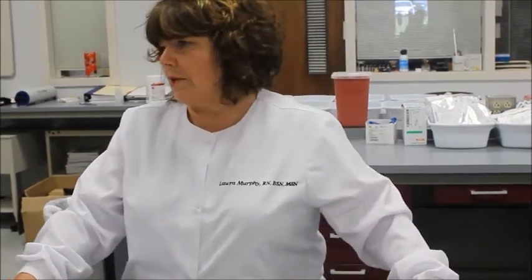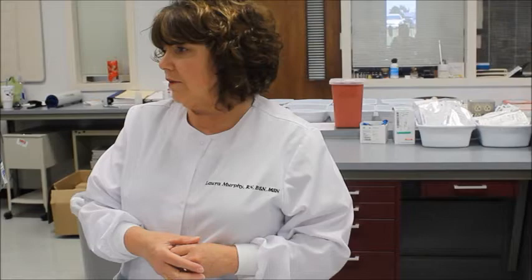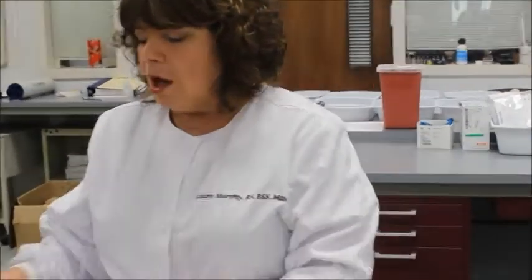Now, IV means intravenous. Access means we're going to leave it in there whether we are giving them fluids or medications. Okay, so to go in and say, I'm starting an IV to start your IV fluids or give you medications, and they say, well, I'm not on any IV medications. Okay, we want intravenous access so that if they should need IV fluids or IV medications, we already have it up and running. Okay? All right.